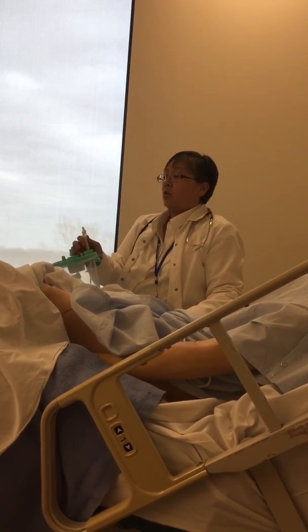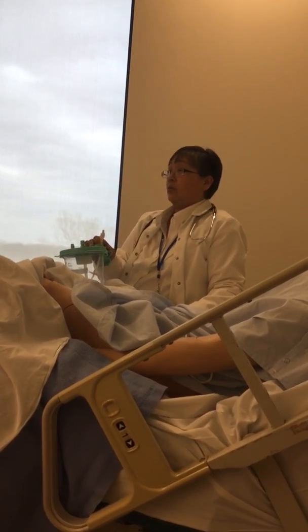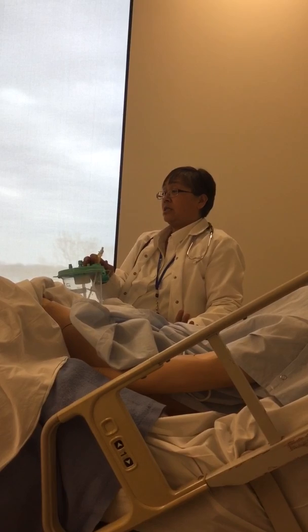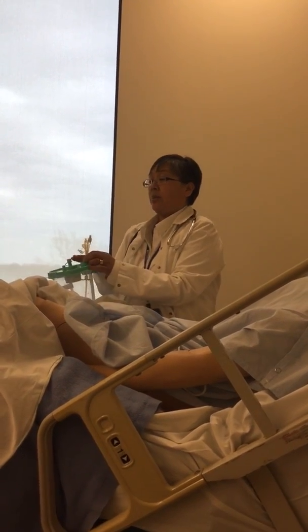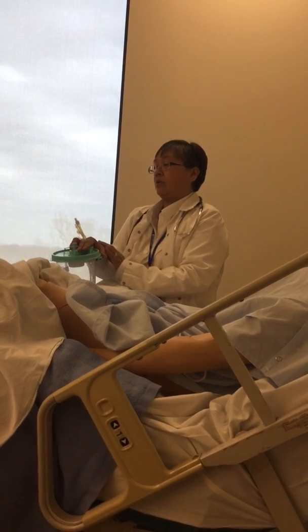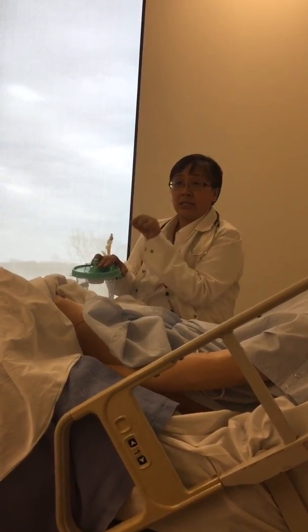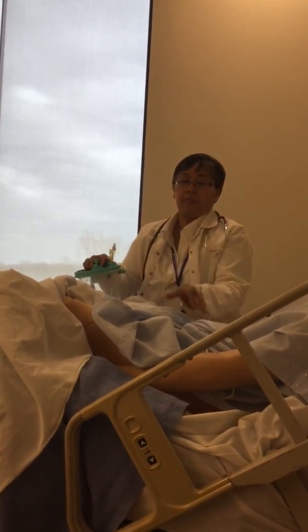Okay, so first thing is I want you to always look at the site. Before you give any medications, this might be sutured in, so there might be a little gauze that wraps around the tube like this. But take a peek underneath there just to make sure that it's in there okay.